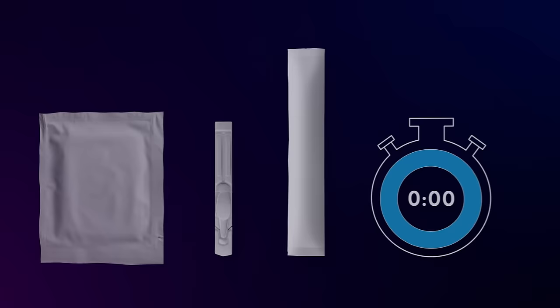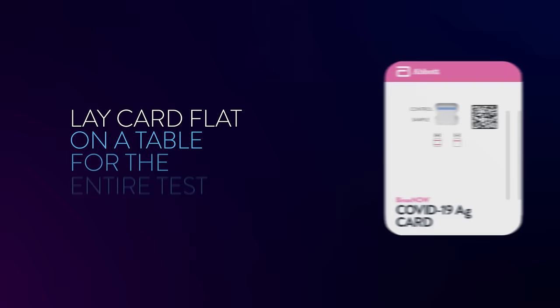Take one test card, one dropper bottle, one swab, and your timer. Remove the test card from the pouch and lay it flat on a table for the entire test.